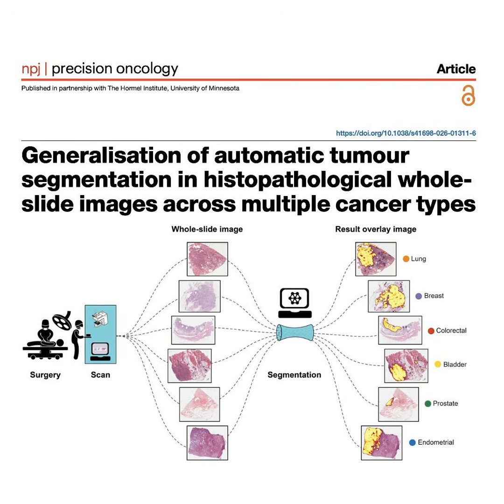Okay, let's do our third mini recap, tracking the results of the ultimate test. Here we go. Bullet 1. The AI successfully recognized breast cancer without any prior training, proving it really did learn universal cancer traits. Bullet 2. Overall accuracy was excellent, usually above 80 to 90% overlapping with human doctors. And bullet 3. It failed on fragmented early-stage bladder cancer because its built-in safety thresholds erased the weak, isolated signals.